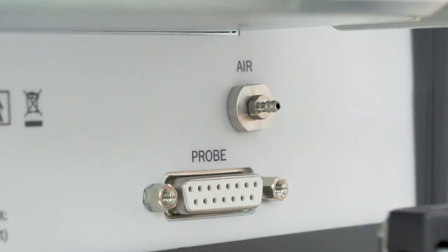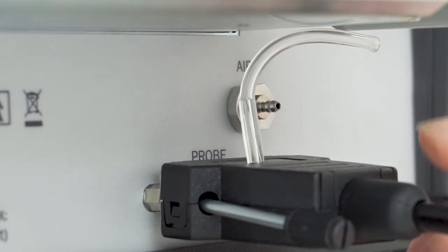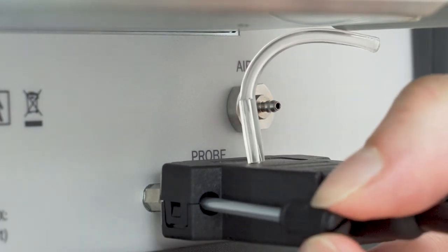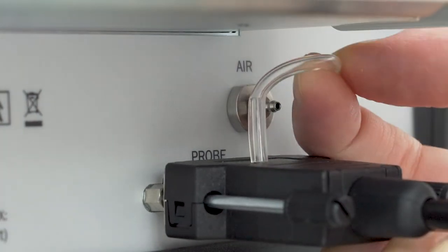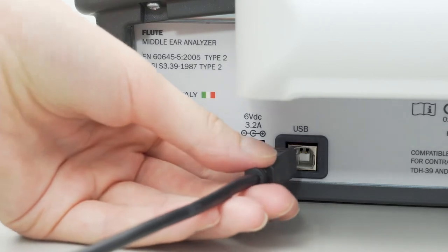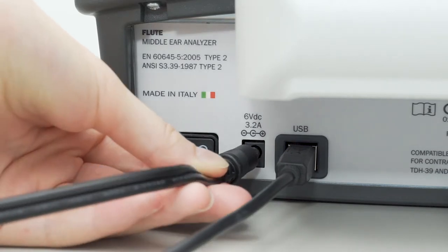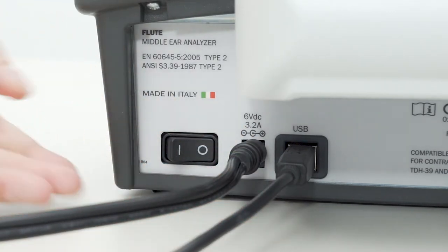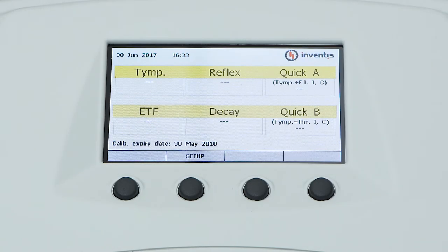All connection plugs for accessories are located on the rear panel. Plug the control box, the air tube, and the USB cable for connection into the personal computer. Once all cables and leads are connected, the instrument can be switched on from the rear panel. A few seconds after power up, the display of the instrument will show the main screen.